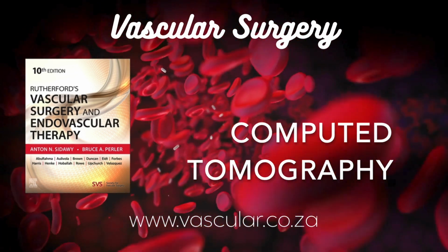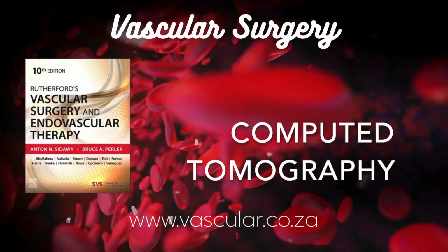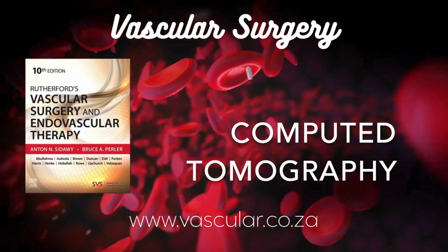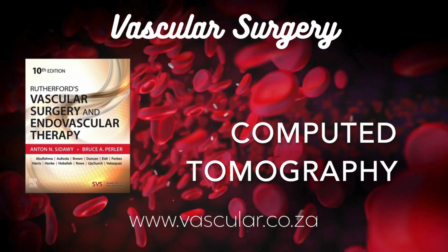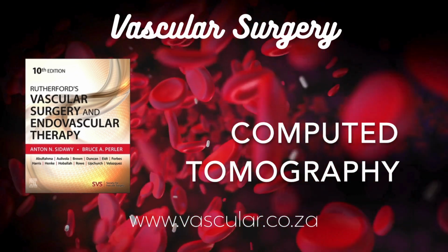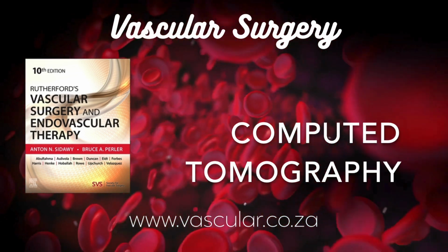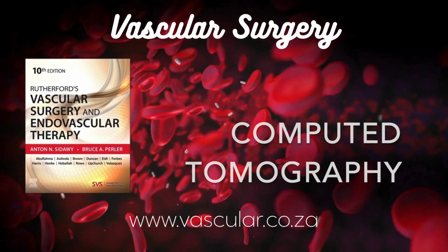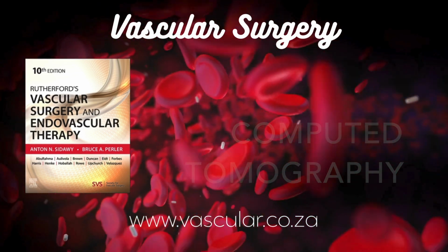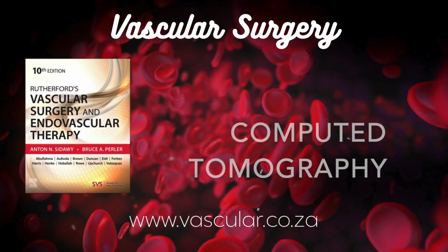A pitch greater than 1, maybe up to 2, means the table moves faster, covering ground quickly with some gaps between the spirals. Good for speed, lower dose, but risks missing tiny details or causing artifacts if it's too high. And less than 1? Pitch less than 1 means the spirals overlap significantly. The table moves slower. This gives you really good data for high-quality 3D reconstructions, but increases the scan time and the radiation dose because you're scanning the same tissue multiple times. So it's another balancing act. Always. Finding the sweet spot for pitch depends on the clinical need: speed versus detail versus dose. The calculation is a bit different for multi-slice scanners, but the principle's the same.